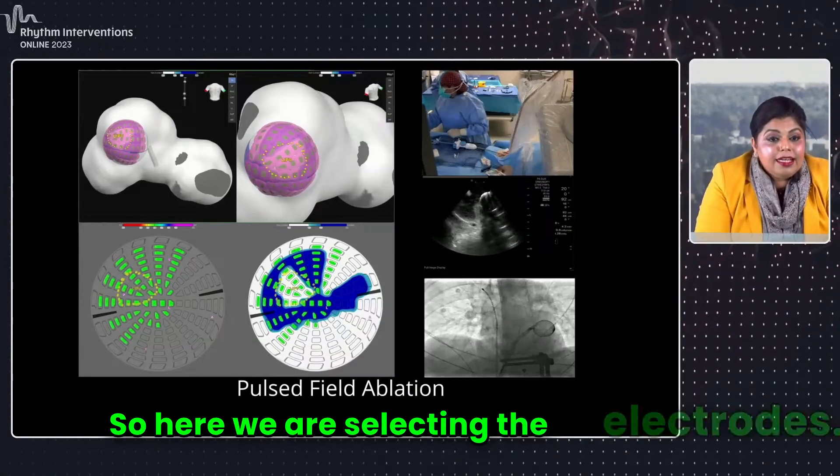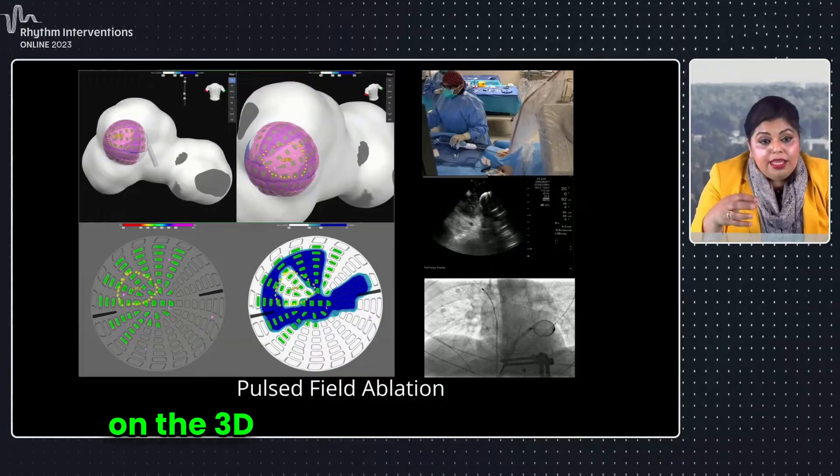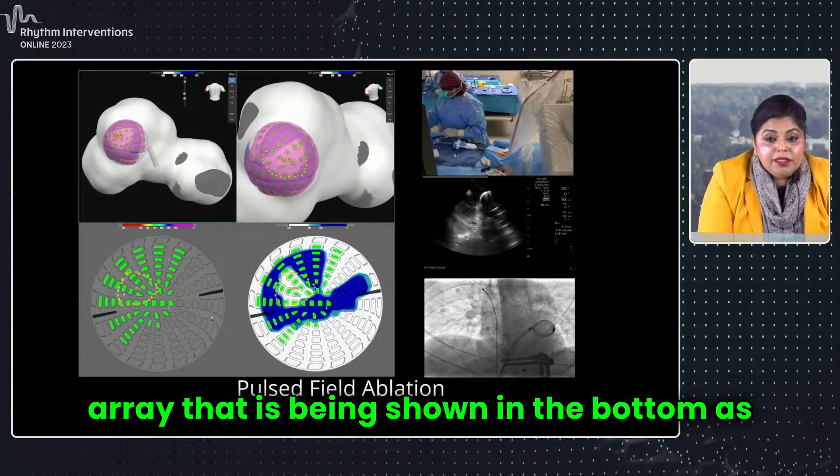Here we are selecting the electrodes. You can see it on the globe, you can see it on the 3D map, and you can see it on the array that is being shown at the bottom as well.